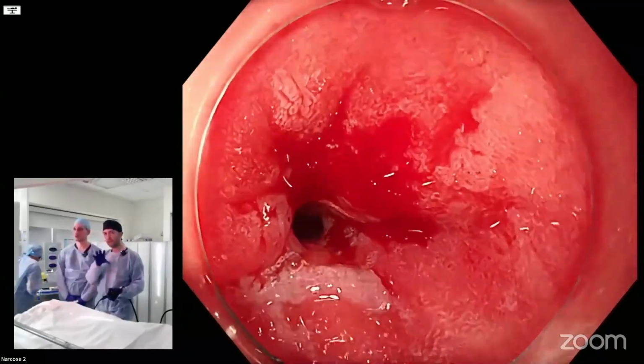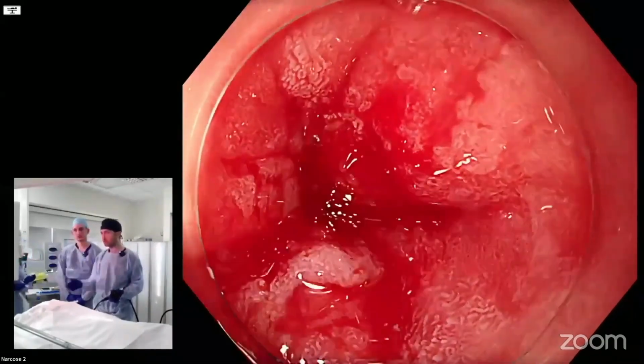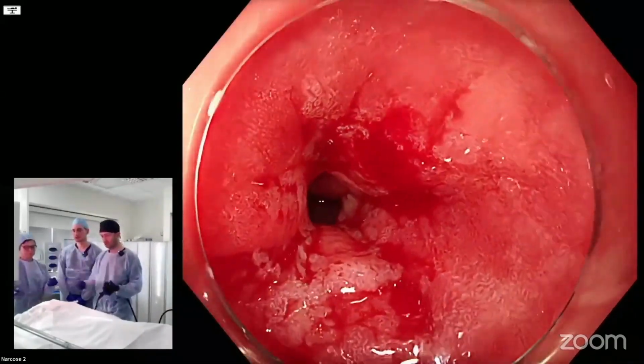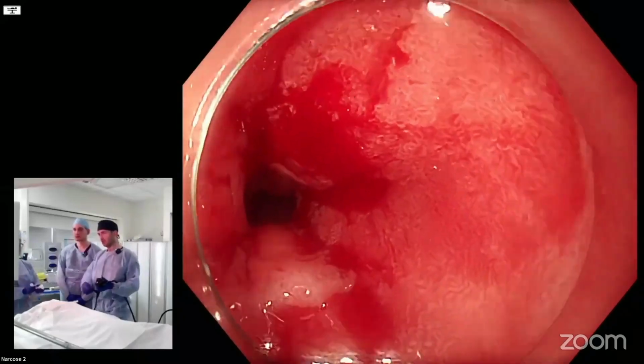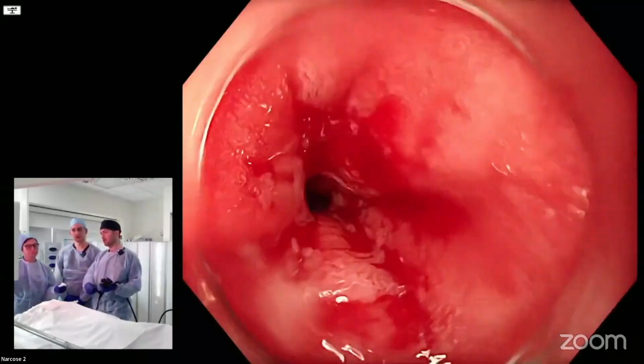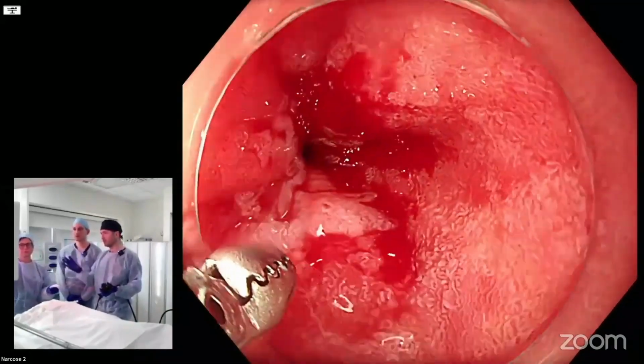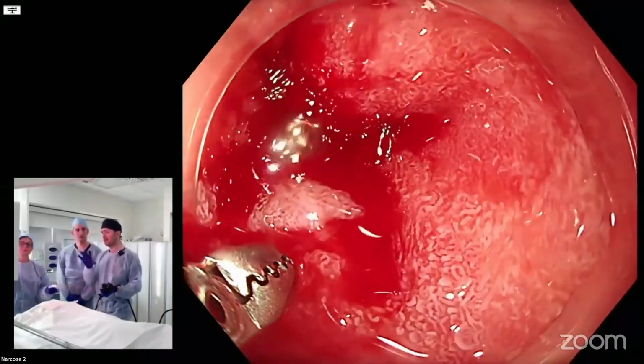Very important, targeted biopsy: do not take two biopsies, because if you take two, there's a 50% chance you lose the first one, right? Second thing is, if you want to take blind Barrett's biopsies, which is what we're doing here because we saw nothing, these are Seattle protocol biopsies, never any dysplasia.